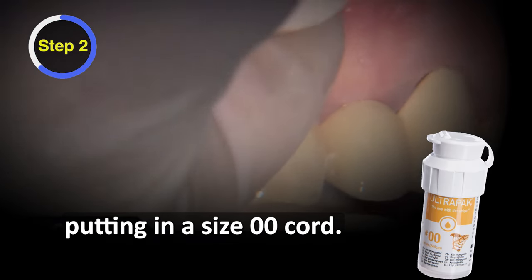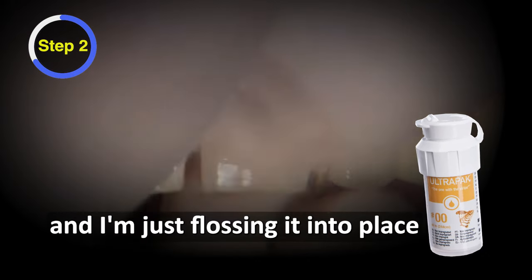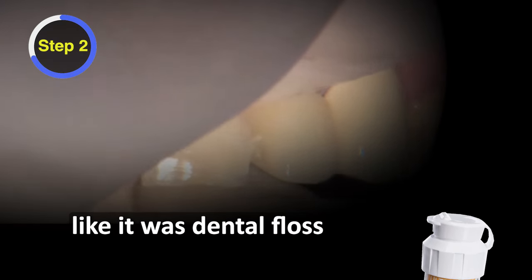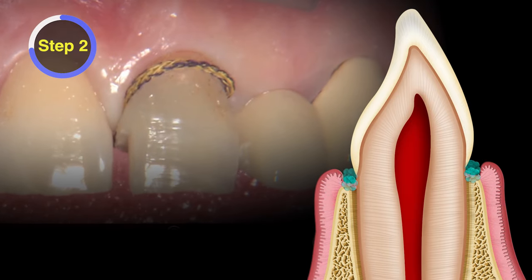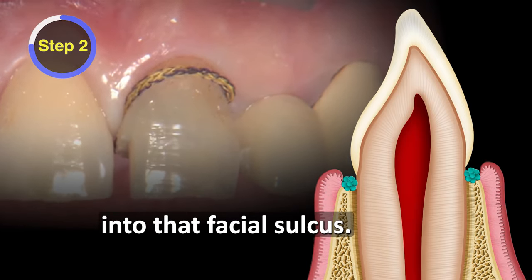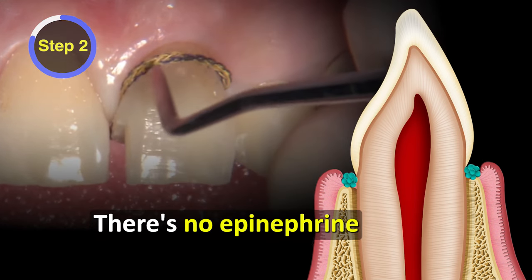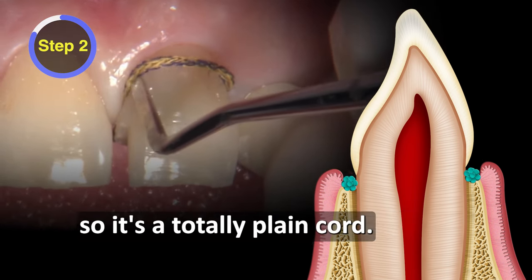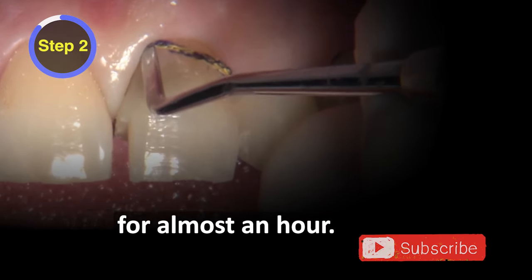Here we are putting in a double zero cord. This is an Ultra Pack cord from Ultradent, and I'm just flossing it into place like it was dental floss, then leaving a little excess on the facial so I can pack that down into the facial sulcus. This cord hasn't been soaked in anything — there's no epinephrine or anything in the strands. It's a totally plain cord, and the reason for that is it's gonna be in place for almost an hour.